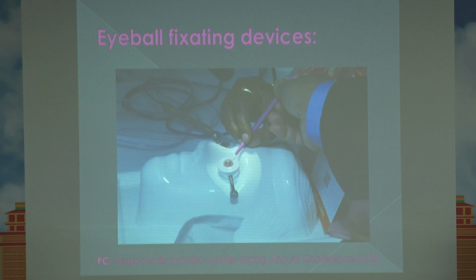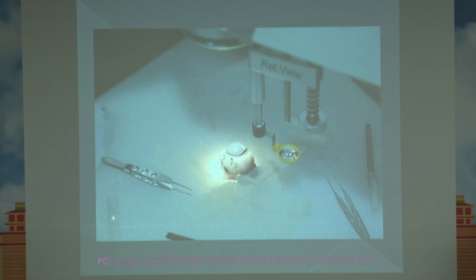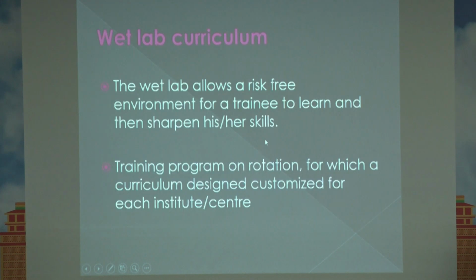This is the eye fixating device available for phaco. Here you have seen the wax eyes used for phaco, and we can also have a goat eye fixator. If none is available, we can simply fix the goat eye with a pin, and here you have seen micropore used for doing the surgeries. Nowadays, with no financial interest, Madhu Instruments has made a vertical holder for the goat eye by which anyone can do applanation or gonioscopy. We are using it at the GSI conference.